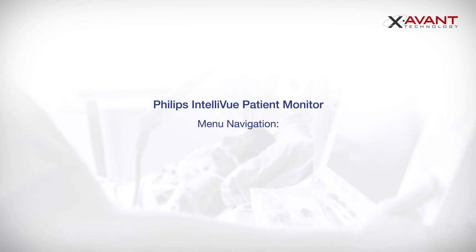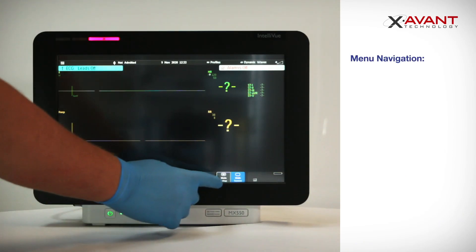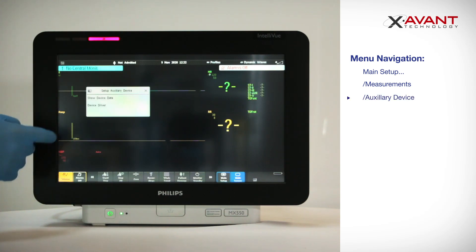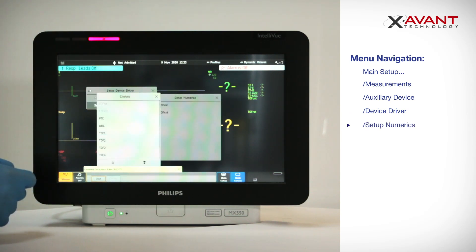You can now continue with the following Philips Intelliview menu navigation to successfully customize the Stimpod to Philips Patient Monitor setup: Main Setup, Measurements, Auxiliary Device, Device Driver, Setup Numerics. Select the appropriate numeric.